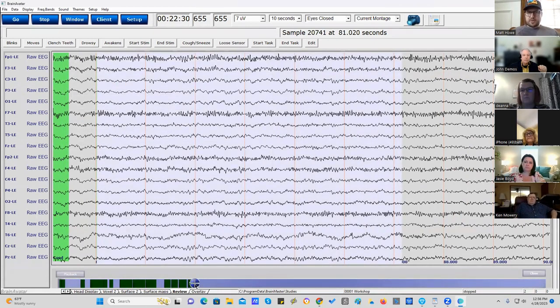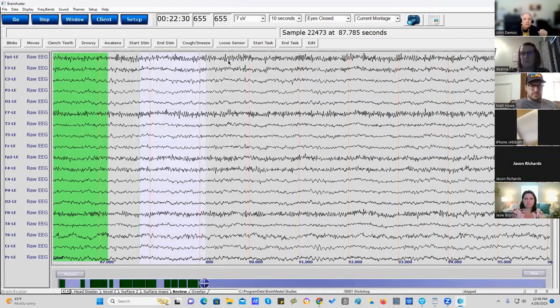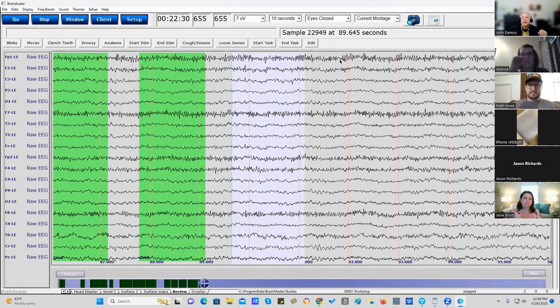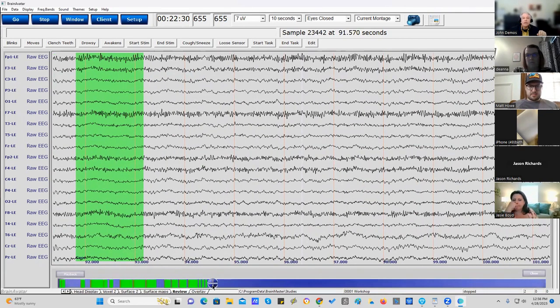Also, you want to get at least a minute of good data, but if you have more than a minute, that's okay as well. But what some clinicians do, when they're new, they'll do things like this. And this is a waste of time. And did you hurt anything? No. But what I look for are longer stretches of data.